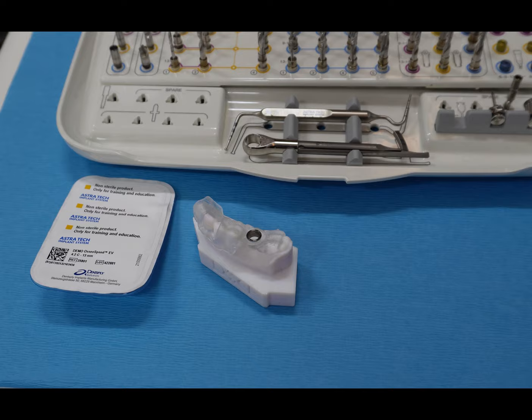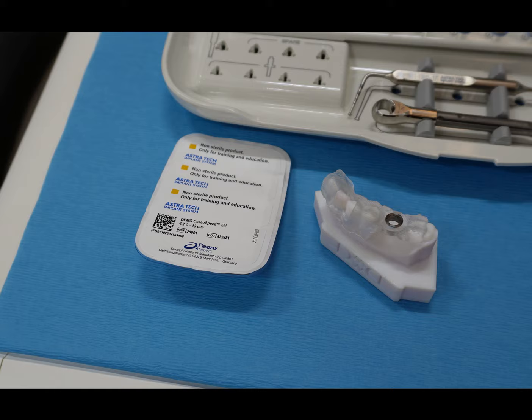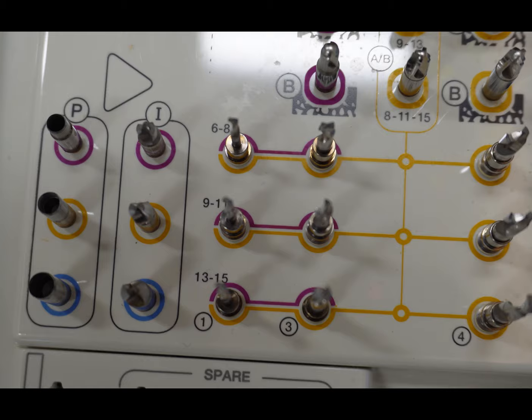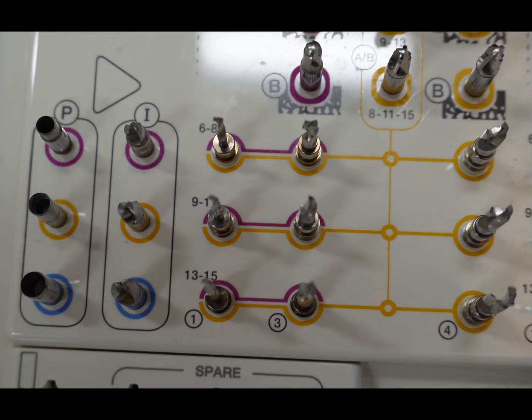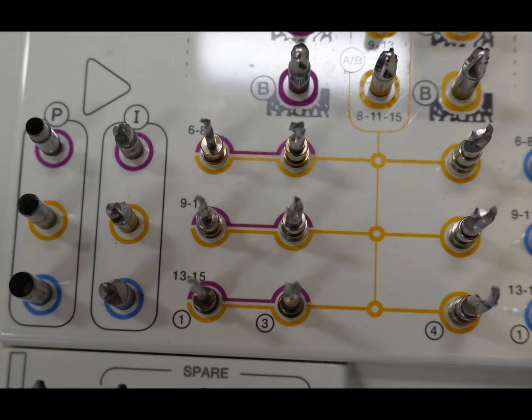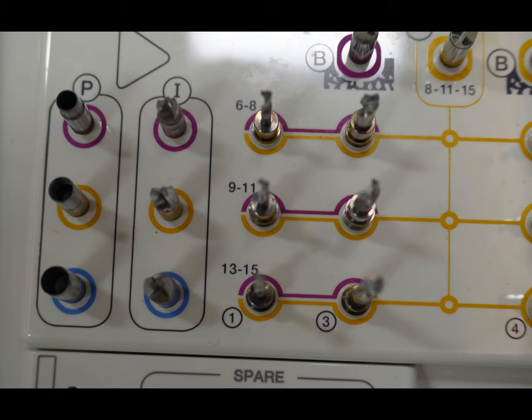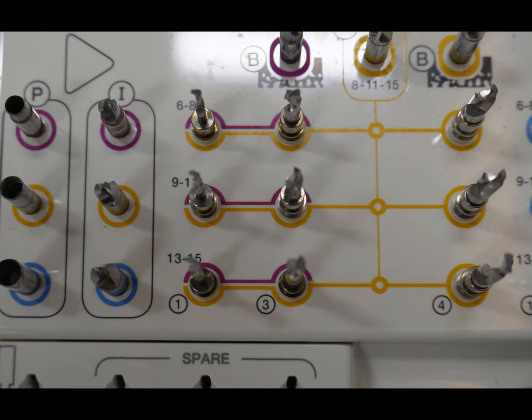Here we have our Astra implant kit, our anatomically correct model with the surgical guide in place, and the implant we are going to place today. Here's a close-up of our Astra guided surgical kit. The P is the punch — color coded to the size of implant. 3.6 is purple, 4.2 is yellow, and 4.8 is blue. The numbers 6 to 8, 9 to 11, or 13 to 15 correspond to the length of implant you're using and the pathway you follow when using your surgical guide.